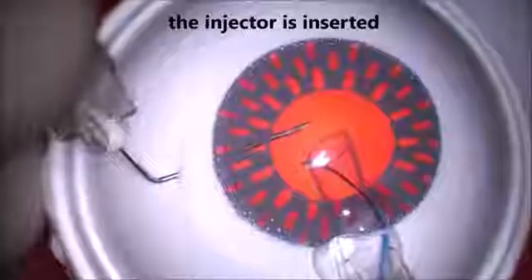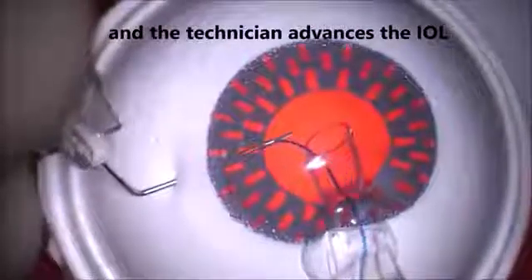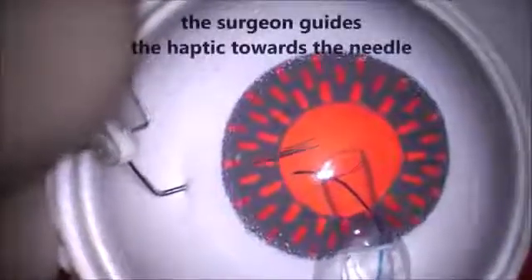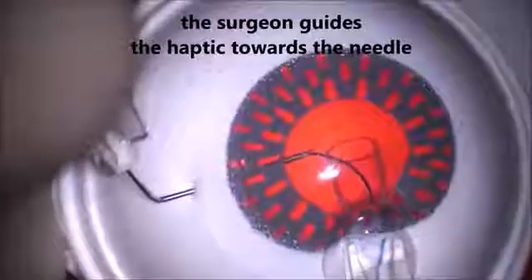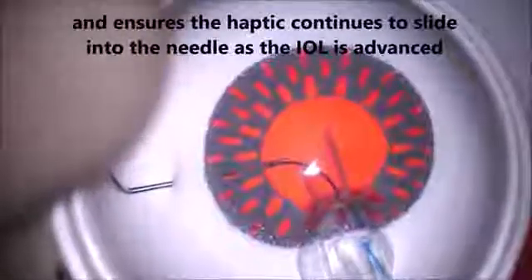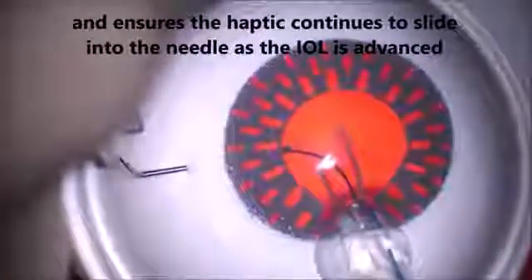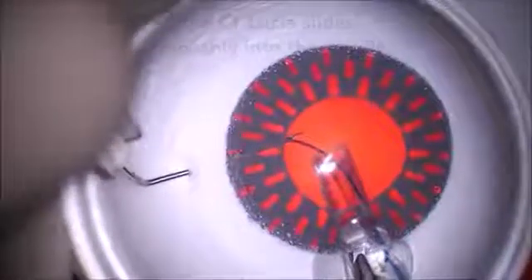As the lens is advanced by the technician, I'm practicing and maneuvering the haptic as well as the needle. I have exquisite control with both hands — my left hand is holding the needle, my right hand is holding the IOL injector. I'm able to very carefully and methodically direct that haptic into the needle. Once I have the right angle, I ask the technician to advance the lens, and the haptic very nicely and smoothly slides into the lumen of the needle. If it doesn't, I ask her to stop and reposition my hands to facilitate threading.